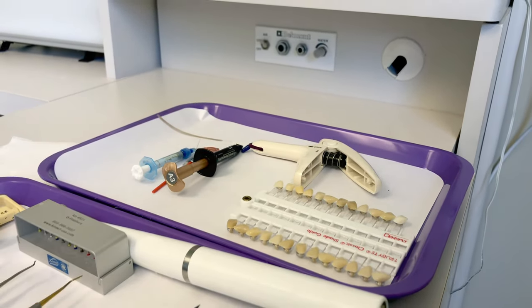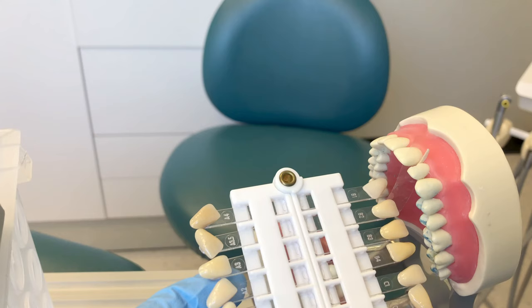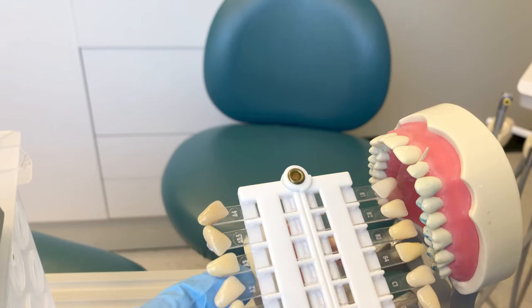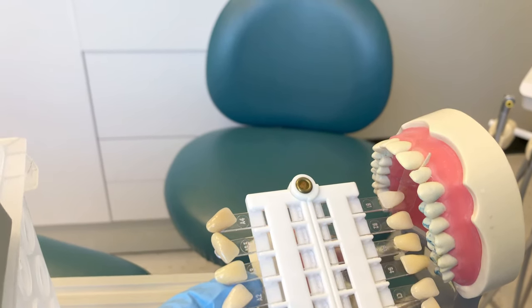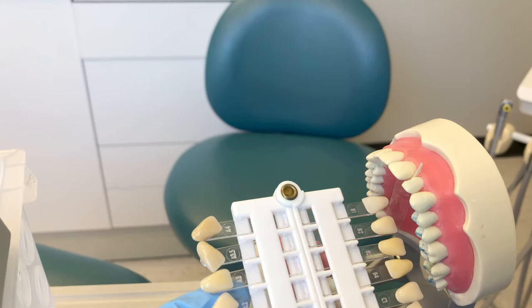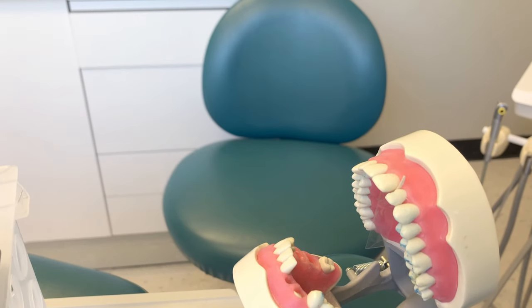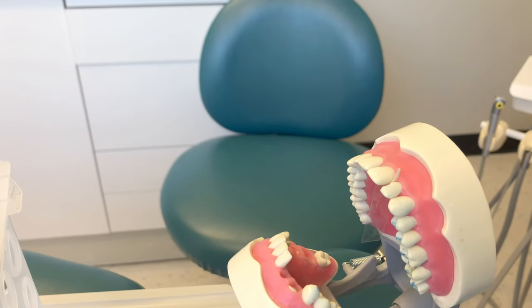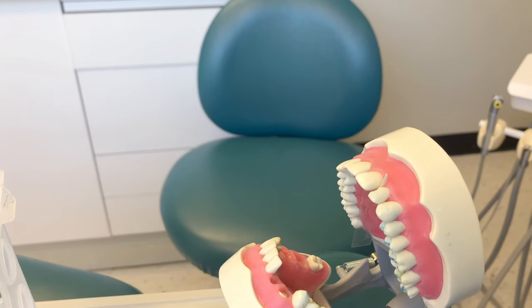As we go through the steps, I'll talk through what each item is used for. Before the tooth was prepared, we took a shade match with our shade guide. Remember to do this before the tooth is prepared, because if you take a shade match after, you may not get an accurate match — as the teeth dry, they become lighter in color.